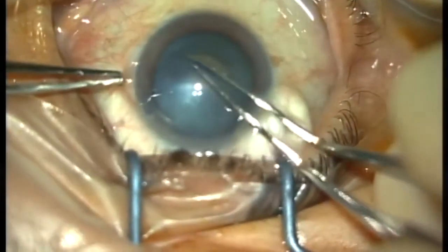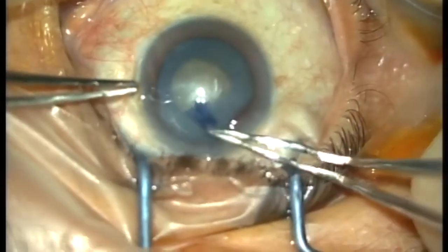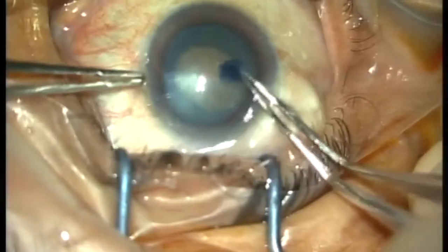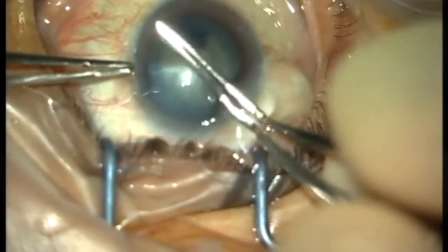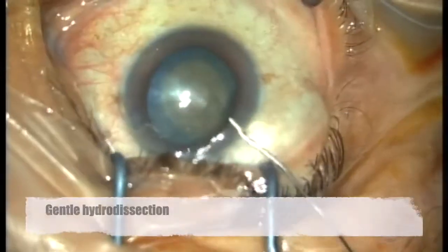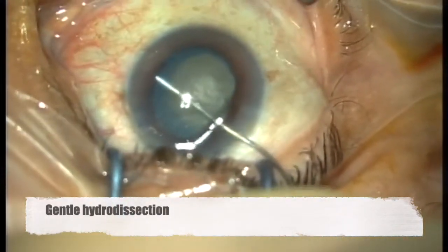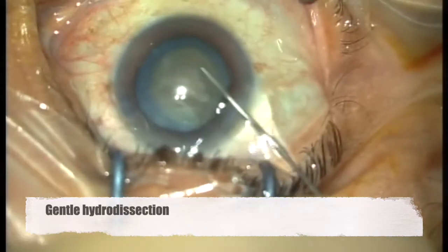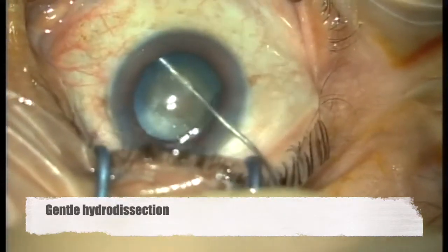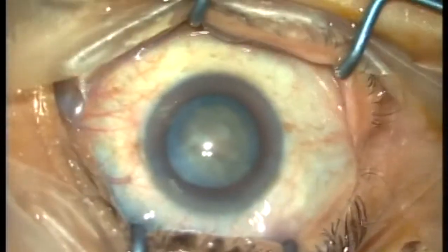Underfilling of viscoelastic and a bulging lens render a risk of extension of the capsulorhexis. Once a big capsulorhexis is created, gentle hydrodissection was made. Note that hydrodelineation is not necessary in this type of case as the bulk of the nucleus is big. And with gentle hydrodissection, we can appreciate the upward movement of the lens.